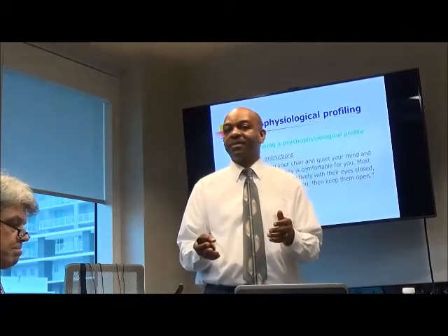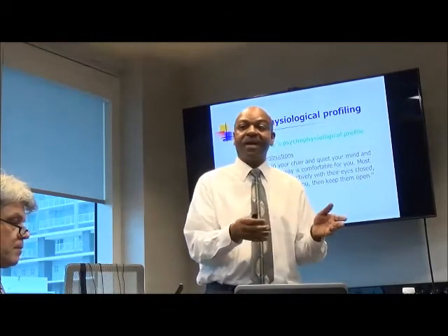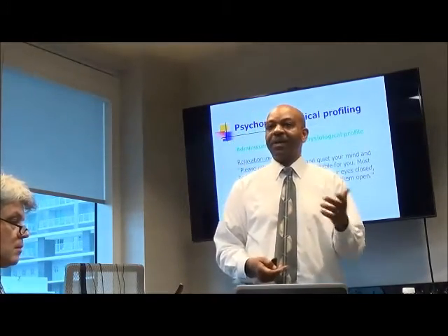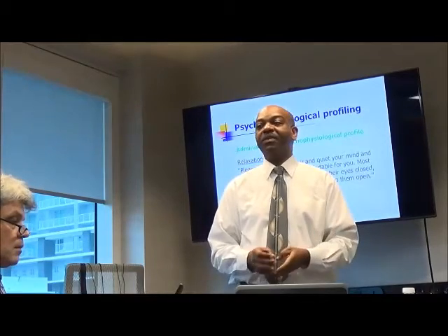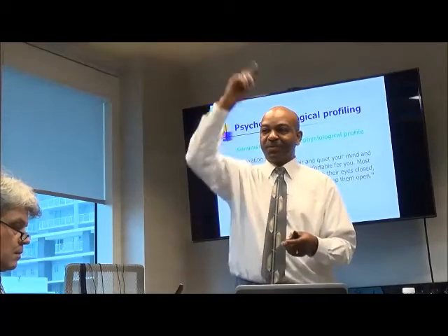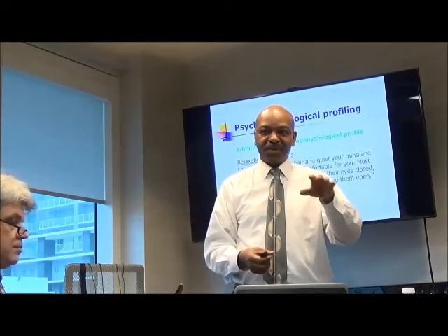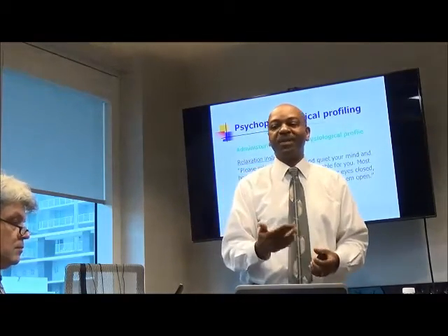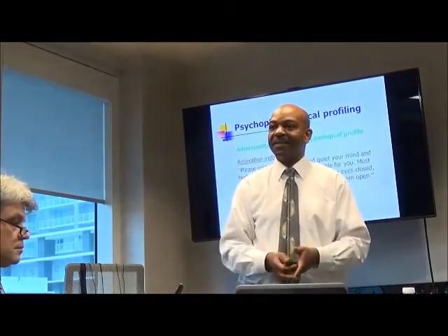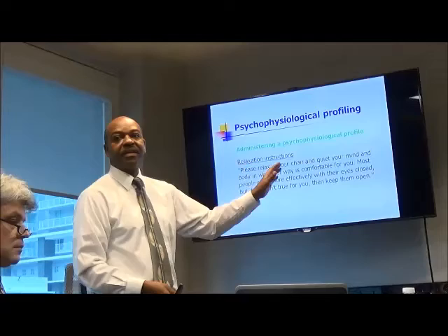But at other parts of the assessment, they would actually see the recordings on the screen, and I feel like you're defeating part of the purpose of doing the assessment, because now it becomes a biofeedback session. Even if you don't explain all of the details, people are smart, and they figure out, okay, I did this and it went up, so now I'm not going to do that anymore, and now they work on trying to keep it low. So you end up losing some of what you would have recorded, because now they have knowledge that they didn't have before. So I always have them not see the screen anytime it's showing their readings.